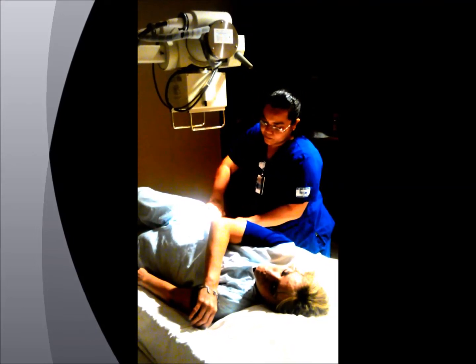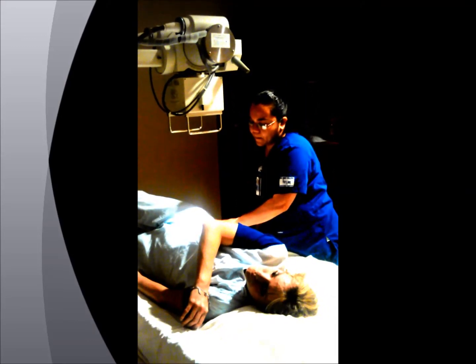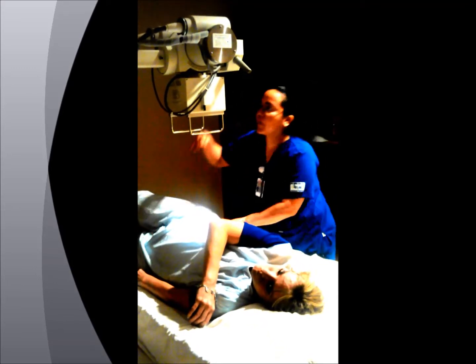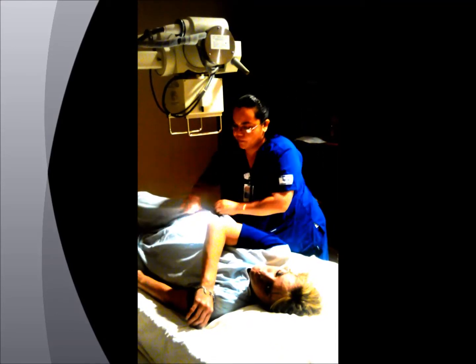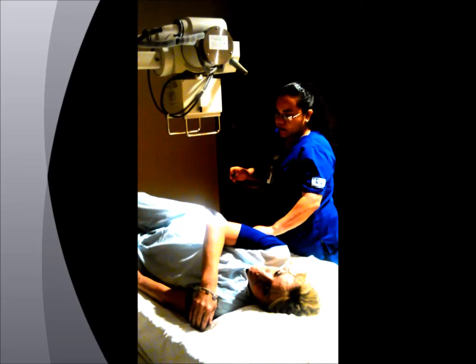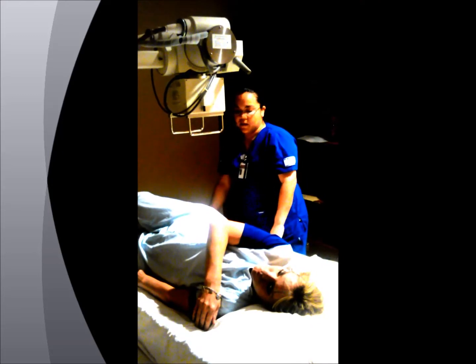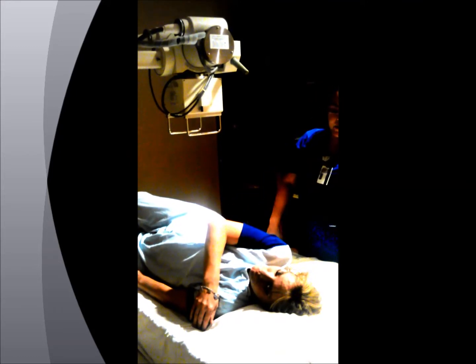Okay, so I'm going to feel for the crest, and you want to center about 1.5 to 2 inches above the crest, and maybe about 2 inches medial of the ASIS. Collimate on 4 sides. And you want to put the marker with the side down, so it will be the left. And just make sure it's out of the anatomy. And just have the patient take a deep breath in and let it out and expose on expiration.